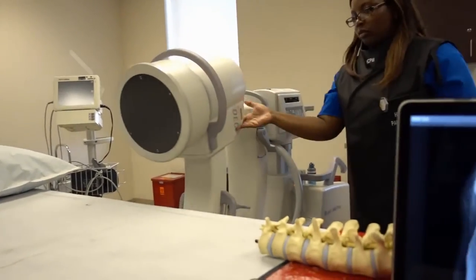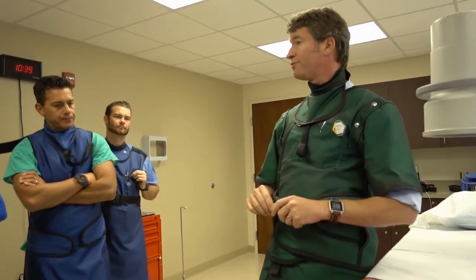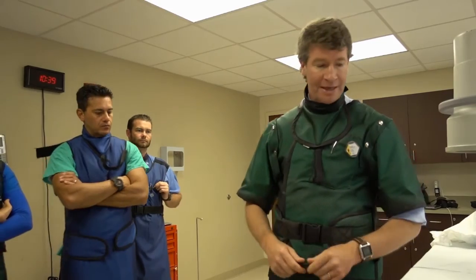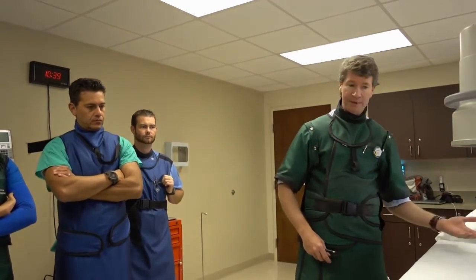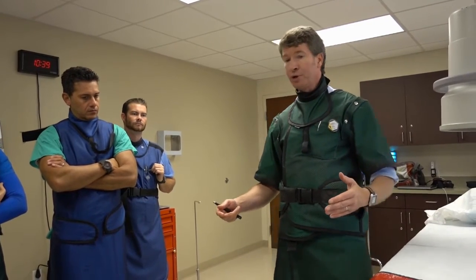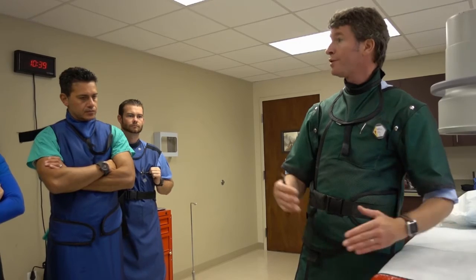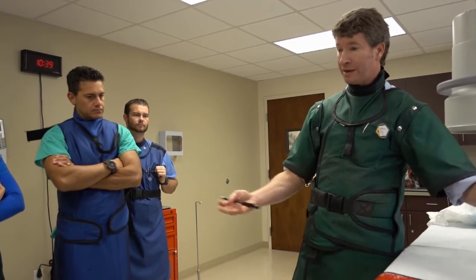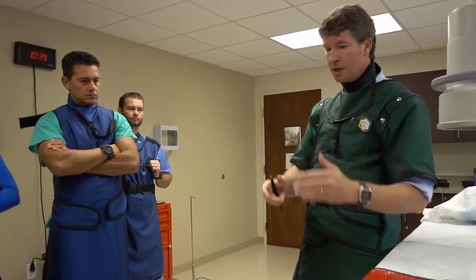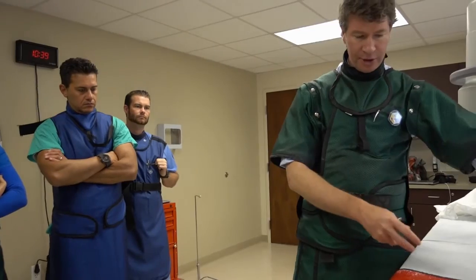So that's the knee. Now, we also do something called genicular nerve block and ablation. They're virtually the same in terms of needle placement. The concept is the patient again in the supine position, they're looking up, their knees out, and generally what we try and do is put a little bolster under the knee that we're going to be working on, or the other knee, doesn't matter, just so that when we take a lateral, we're not looking at two knees superimposed on each other, because then it just clouds the picture. So one's up a little bit. So they've got a bolster, they're prepped, etc., and draped.